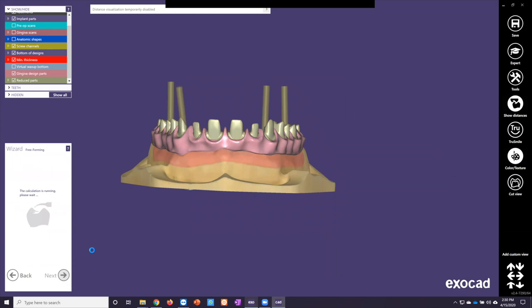At this step, you can make the decision if you're doing the design of the thimble bridge and crowns or copings all in one shot, or you want to split that up into two sessions, so two different workflows. We're going to continue on and design the copings here. I have another case we'll pull up at the end to show you what that would look like. Continue without thimble superstructure would be if this is your stopping point and you want to manufacture this, then rescan it and pull that scan in to design your crowns or copings at a later time. That's how you split it up into two design sessions. So for this first case, we'll leave that design thimble superstructure on and click next.